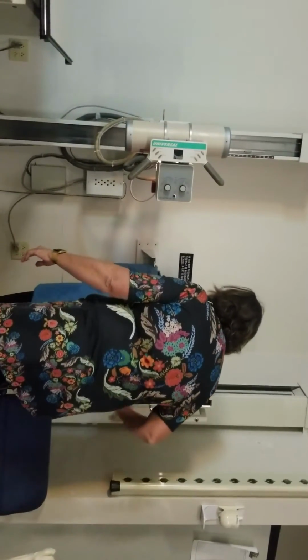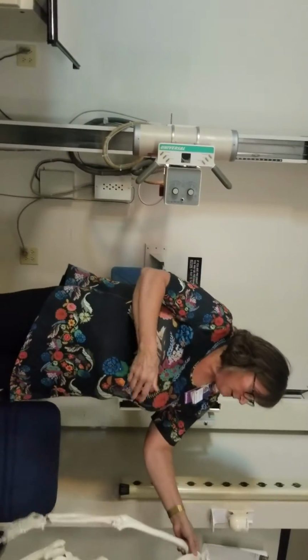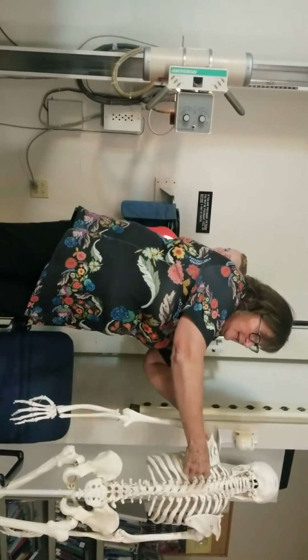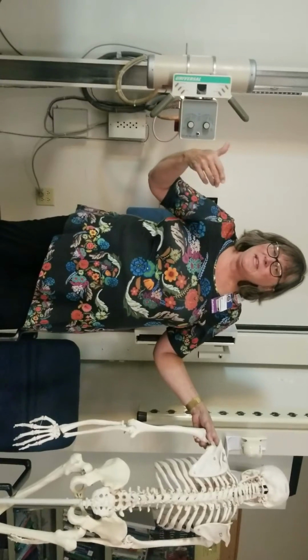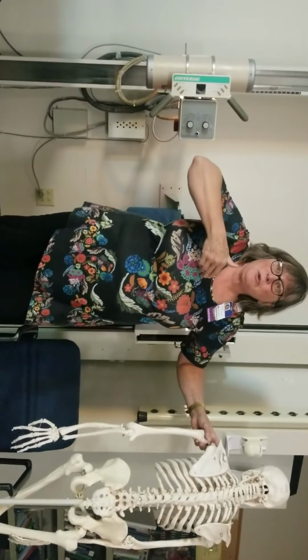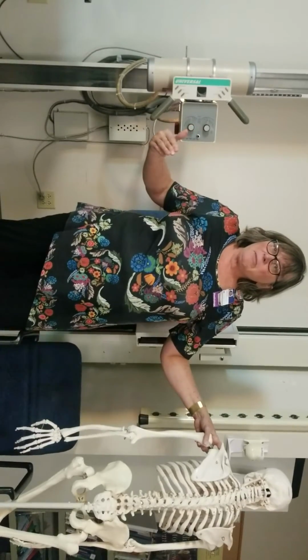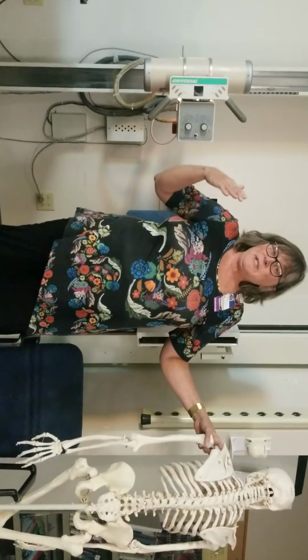And then what I'm going to do for Ellen is, because our scapula right now is the blade, it's really thin, right? And we don't really see it on a chest x-ray when you think about it. Do we ever? But when we do see it, we have them roll the shoulders forward. So how are we going to get this out of the way of the ribs? Roll them. But we still want to make it an AP.